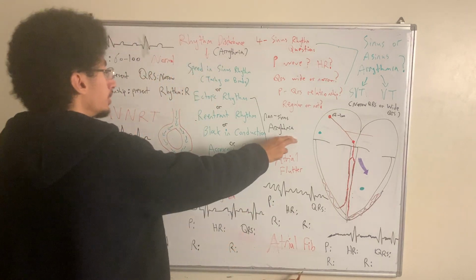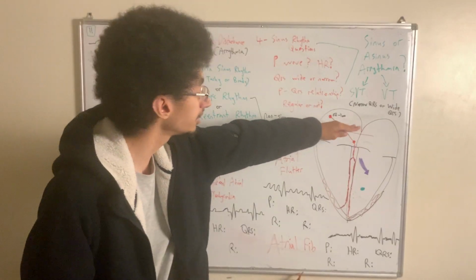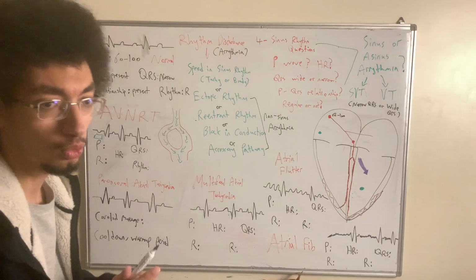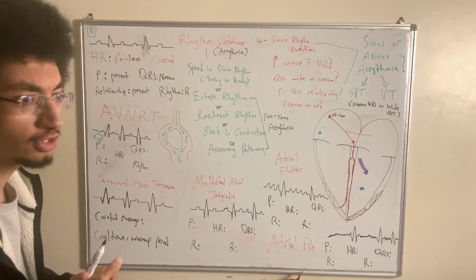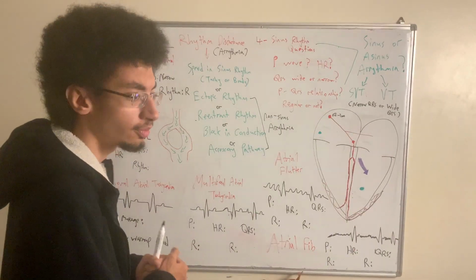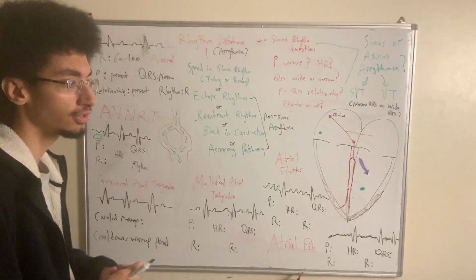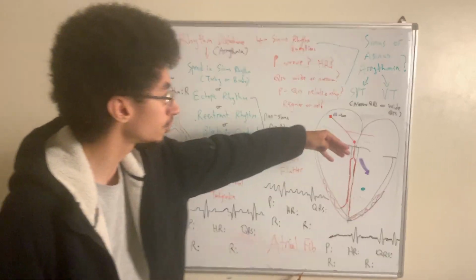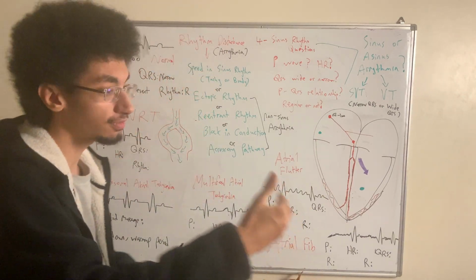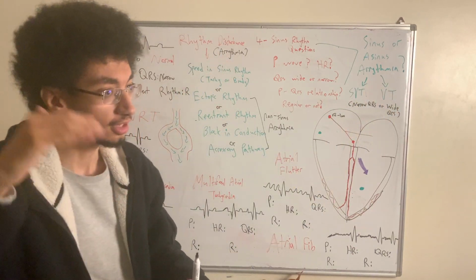Whenever we have a non-sinus arrhythmia, we need to know, is it above the ventricles, a supraventricular arrhythmia, within the right atrium chambers, an ectopic source besides the SA node, or is it below the supraventriculars, within the ventricles themselves? Is this a case of ventricular tachyarrhythmia, in which you have an ectopic source within the ventricles? And there's a lot of differential diagnosis belonging to supraventricular tachyarrhythmia, or narrow complex tachycardia. And we have a lot of differential diagnosis belonging to ventricular tachyarrhythmia, or wide complex tachycardia.